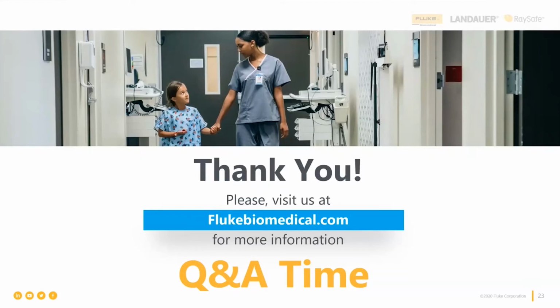And you would think that, well, then I don't need to do the test, but you'd be wrong. That was the one test that absolutely must be done and cannot be avoided for electrical safety. And so you use a 10-inch square of aluminum foil, you tape it down to the touchable surface of the medical device, the defib in this case, AED, whatever it is, and you hook your test lead to the aluminum foil. Now think about why this works.